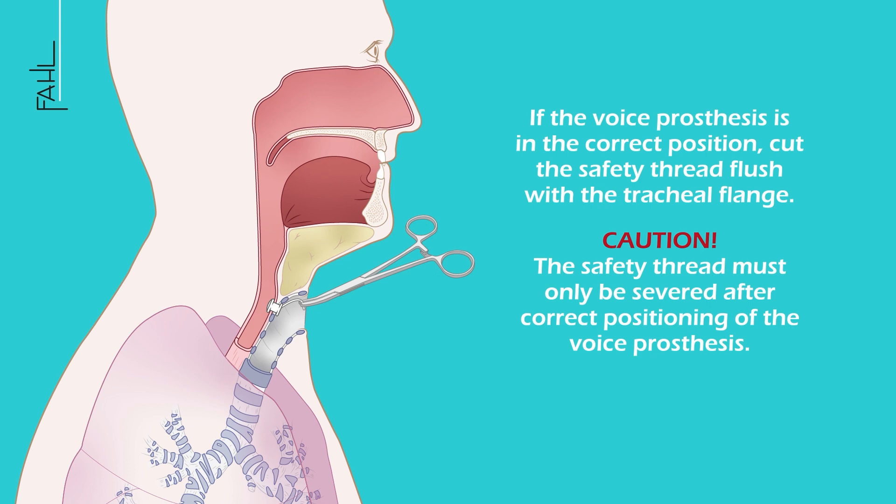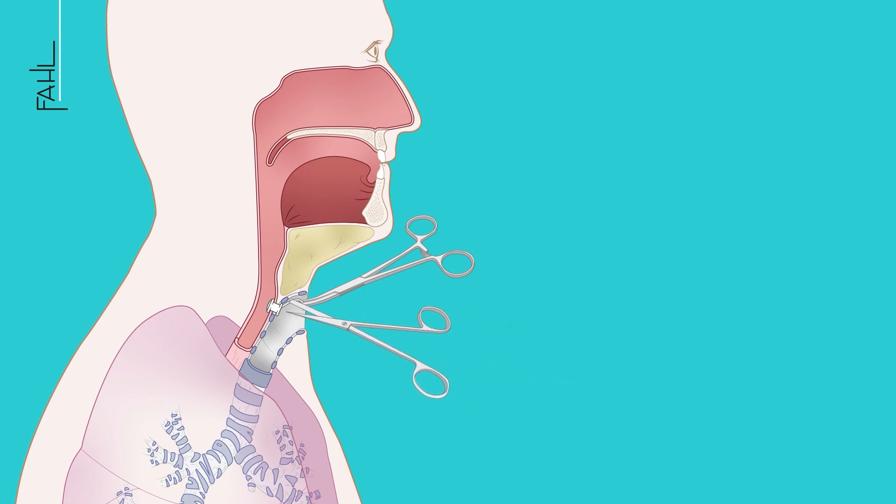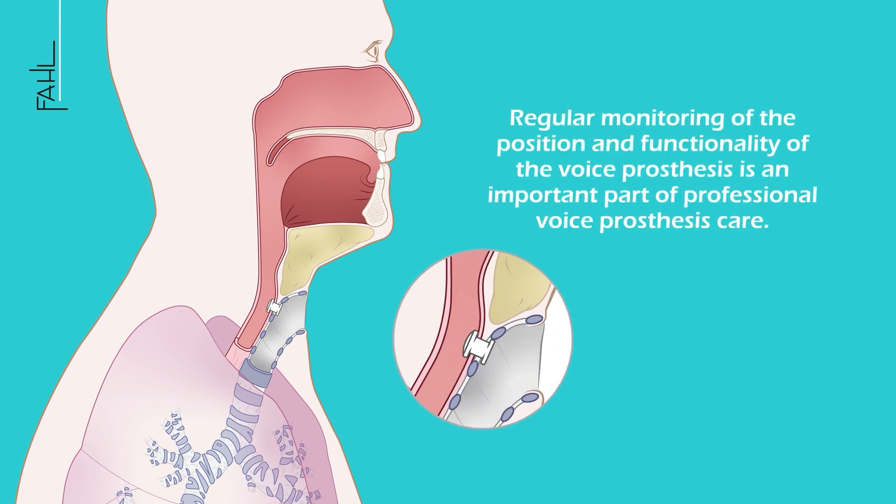Please note: the safety thread must only be severed after correct positioning of the voice prosthesis. Special note: regular monitoring of the position and functionality of the voice prosthesis is an important part of professional voice prosthesis care.